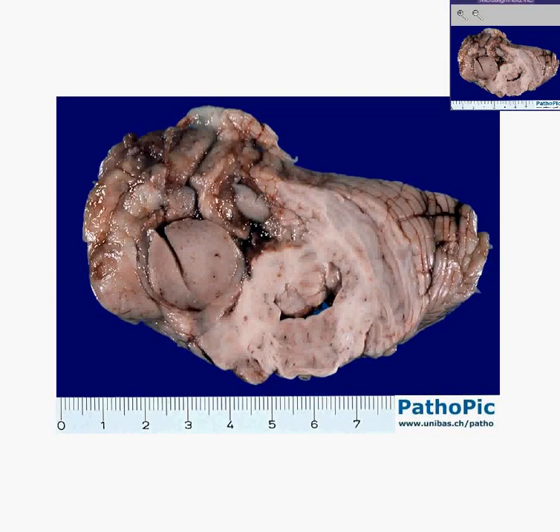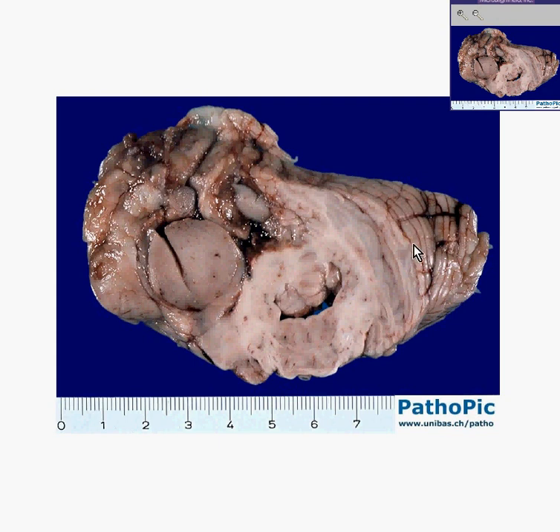Here is another brain tumor. We're getting pretty good at picking these out quickly because they look so much different from the normal brain. Notice this is a cerebellum because you have these small folia, which are linear, rather than the larger, more irregular gyri and sulci which you see in the cerebrum.